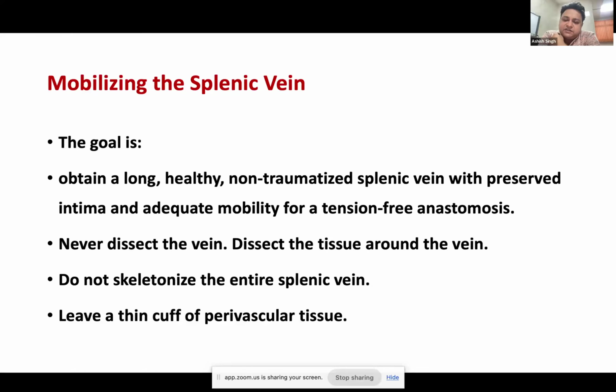In mobilization of the spleen, as madam and sir have said, it is very important to go through a simpler area and keep the difficult areas for the later portion of your surgery. So you mobilize it all around. In case it is difficult to tackle the gastrosplenic area, that would be the last to tackle. In that case, you probably have to have some window from both sides so that, if required, you can fire the stapler, or with clamping, you can divide and control the bleed as well as the opening or injury to the stomach.